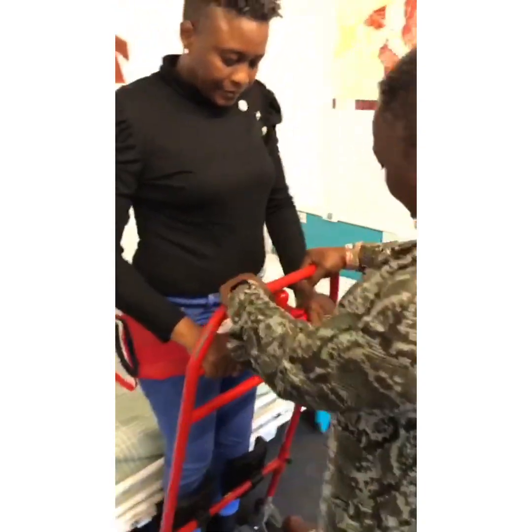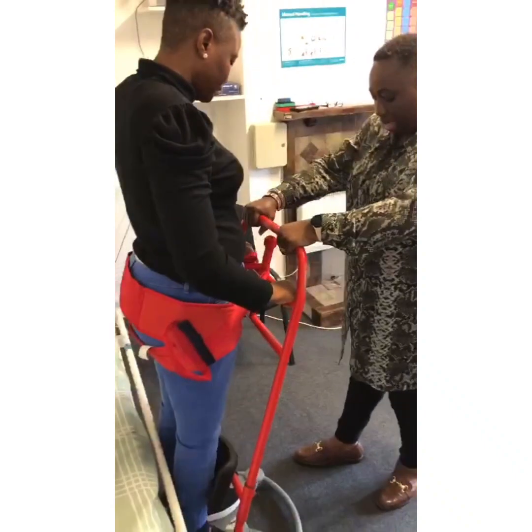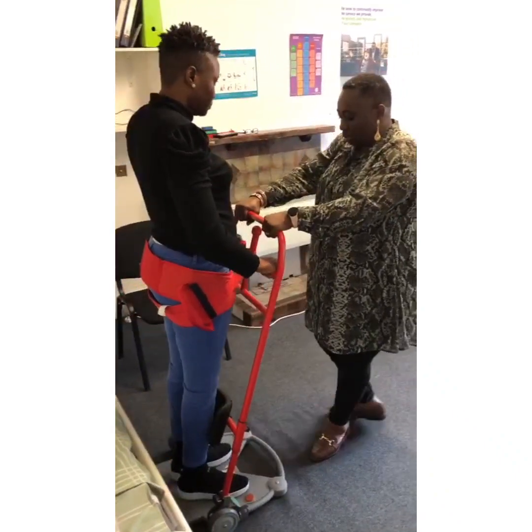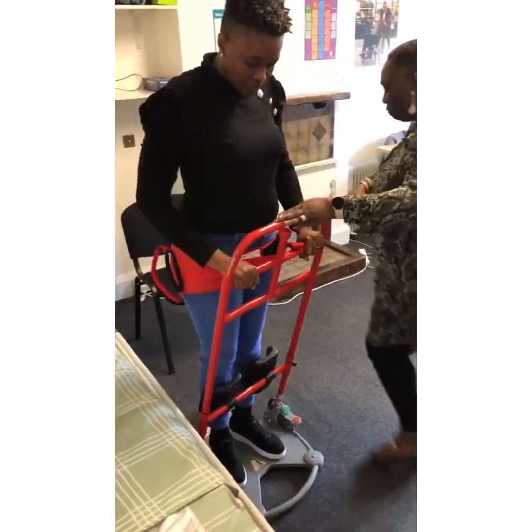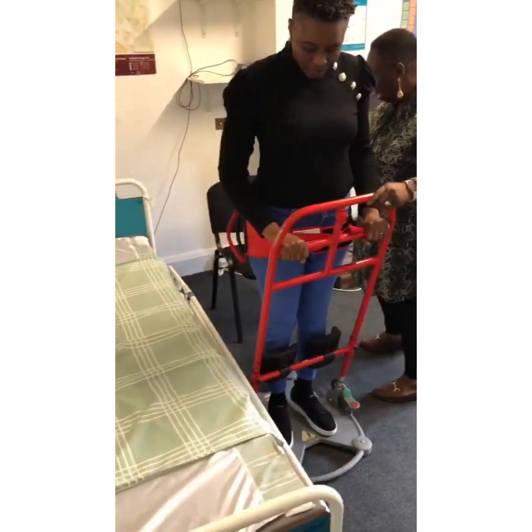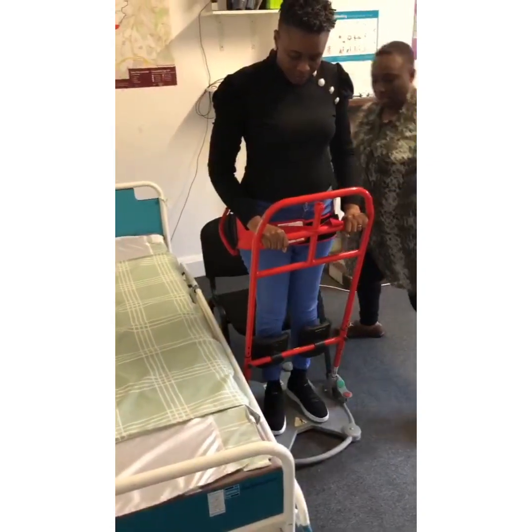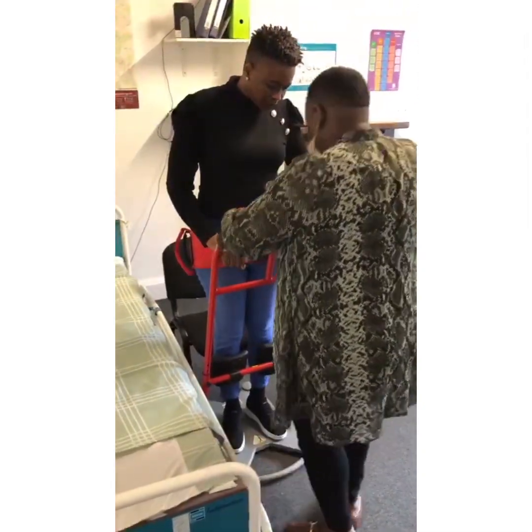Hold on — don't let your hands go off. Brakes up, then I turn her. Remember, I said you have to turn at a 90-degree angle. You don't move it forward, you don't move it backwards — just the 90-degree angle. Then I bring the chair closer.